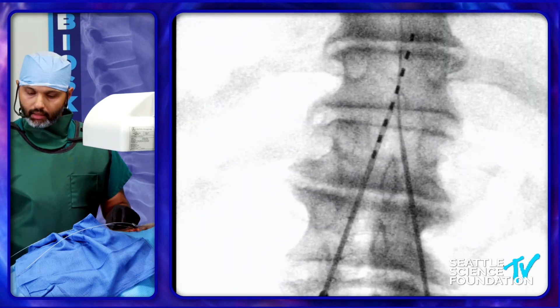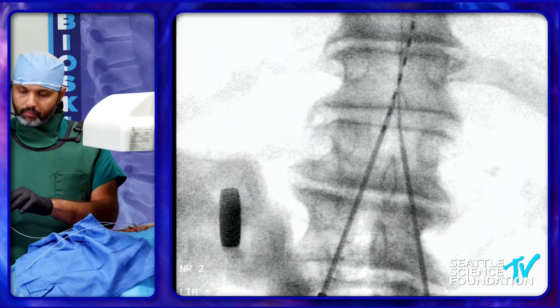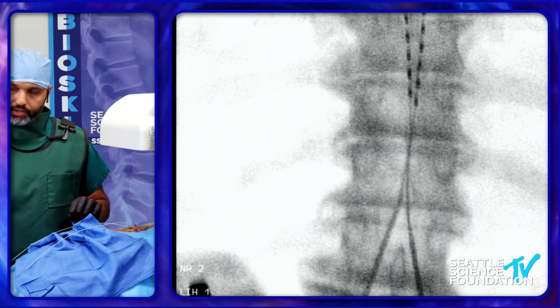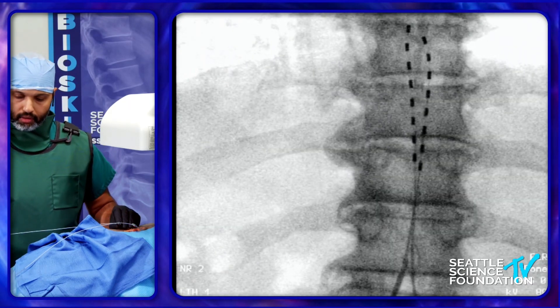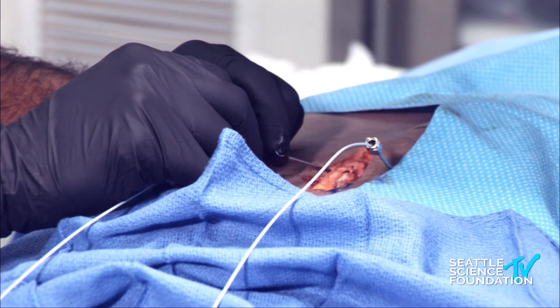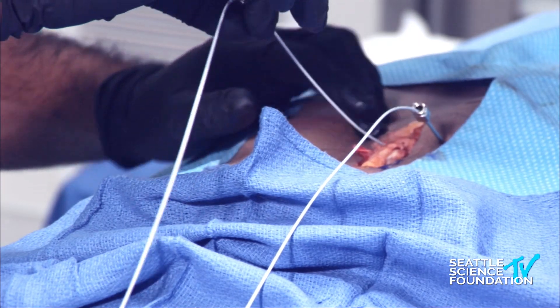This is kind of going in there. Now we'll steer the lead up. Once you have the leads in place and you've removed the stylettes, you're also removing the needle — making sure you're feeding the SCS lead to make sure it stays in the right spot. Now you have your wire there in the space you need.